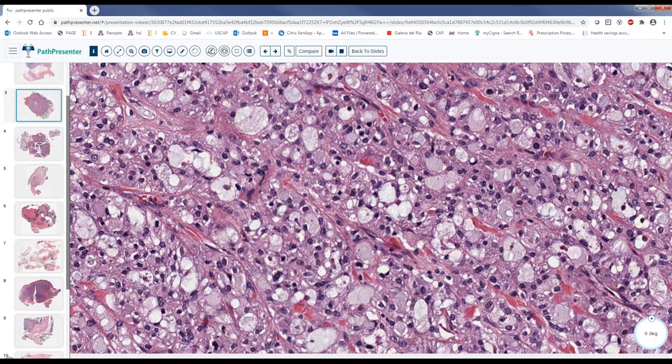All right, I see that most of you go with secretion. I agree, and this is secretory carcinoma. Anyone would like to comment? What is the diagnosis? If we are in 2009 right now, in a group here, and this is 2009 or 2010, and I give you this lesion, what would your diagnosis be? Excellent.